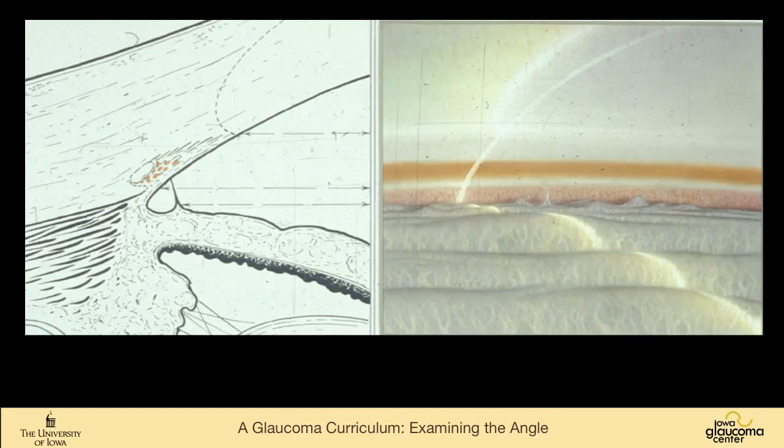A picture we've seen before, a painting we've seen before. This is again inserting deep. We can see this is ciliary body face, scleral spur, pigmented trabecular meshwork. Schwalbe line is right here. The iris is flat. And there's 2+ pigmentation. So D45F2.